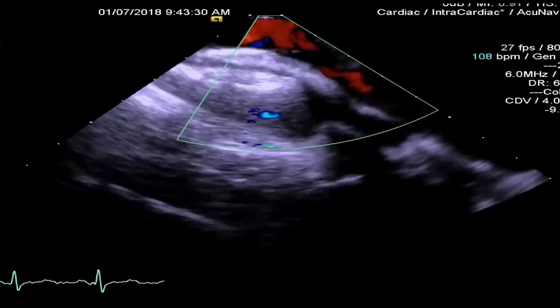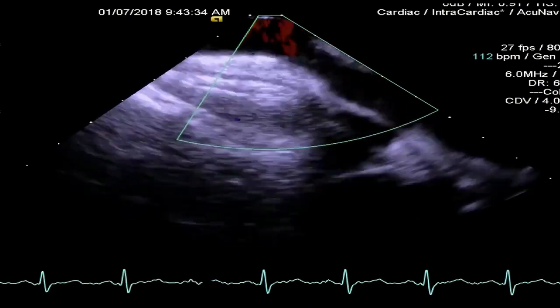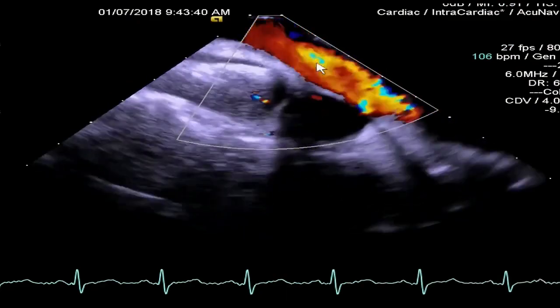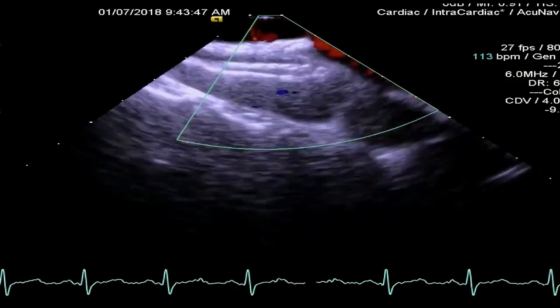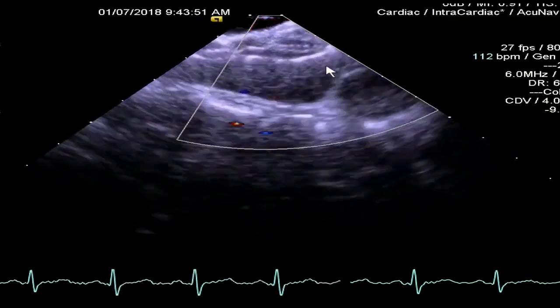That is the superior vena cava. Are you able to see, Dr. Srinivas? Yes, we are, very well in fact. Yeah, so that is the superior vena cava with the red color coming. Now I am torquing it, so that this is just confirming that the superior margin has been caught well. Yeah, that we can see very clearly.